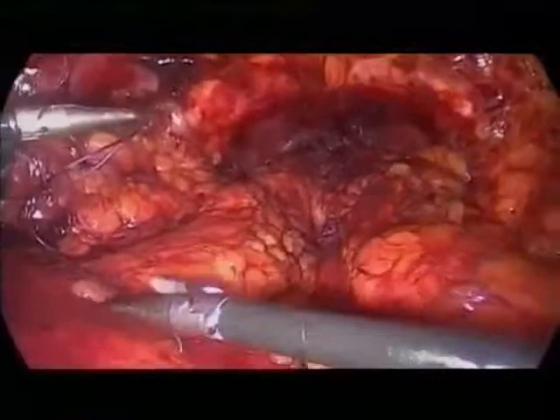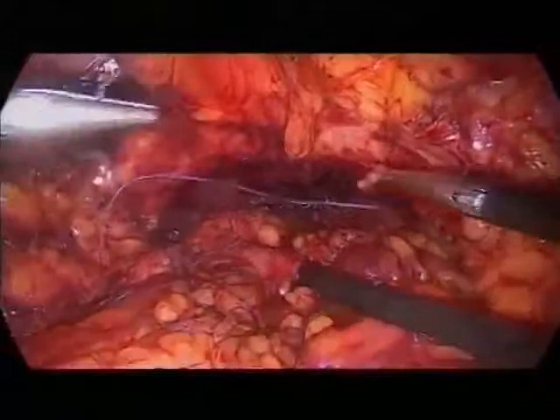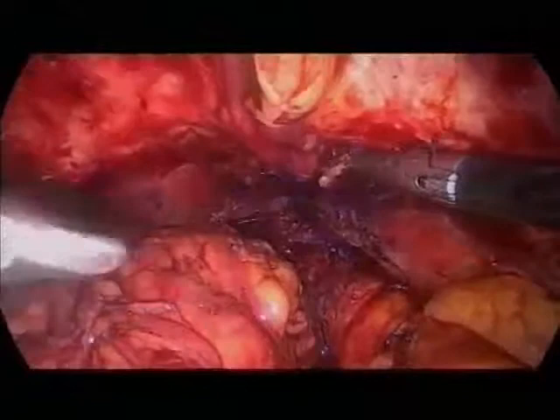I push the pelvic fascia. Under you have the Santorini plexus. Beautiful. I push it. So maybe for the last stitch we go to Jens-Uwe and then we come back. Everyone knows now the anatomy.